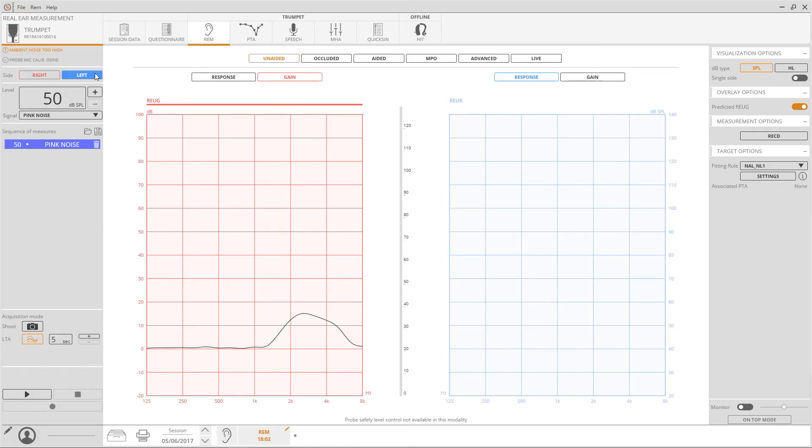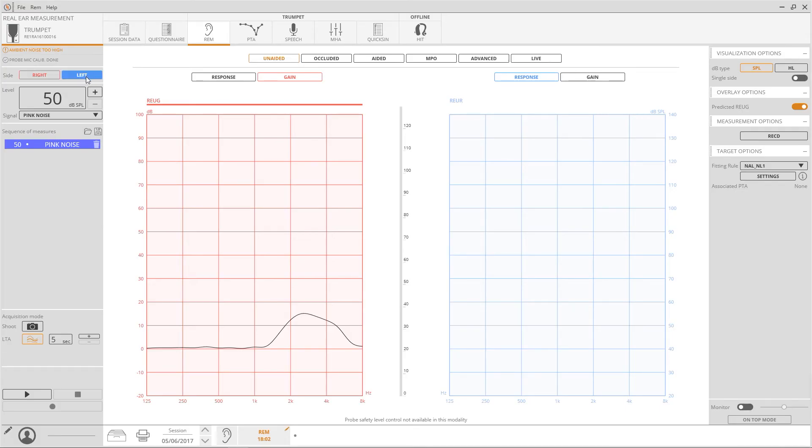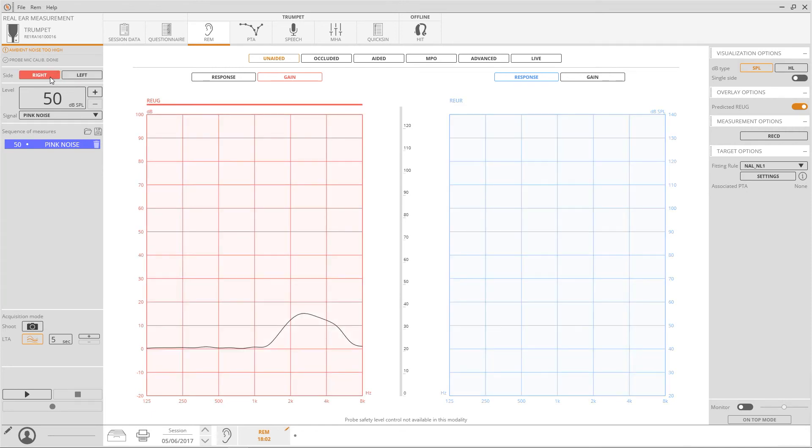On the left panel, you can find controls related to the acquisition settings: side under test, stimulus type, intensity, and acquisition mode. The acquisition mode can be set as a long-time average measurement, or as a snapshot of the curve visualised.